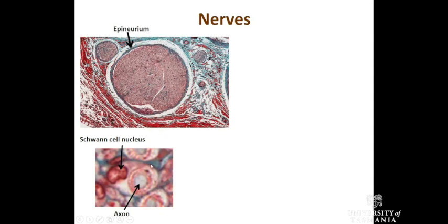And then around each individual Schwann cell, so here we've got a Schwann cell, here's its nucleus, here's its cytoplasm, here's our axon, and here's our myelin sheath. Remembering, myelin sheath is basically just a wrapping of the cell membrane, and being largely lipid, gets washed away for microscopy, so you often end up with this sort of pale region here. And this little blue line here on the outside represents the endoneurium, so the layer of loose connective tissue around the outside of Schwann cell and the myelin axon that it's associated with.